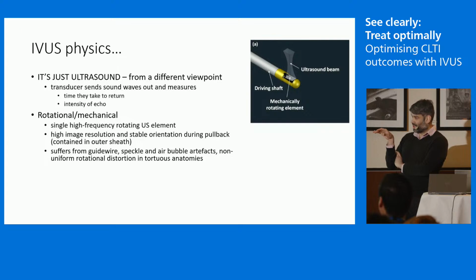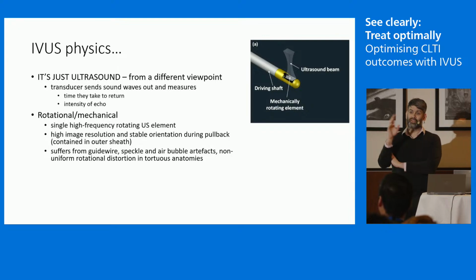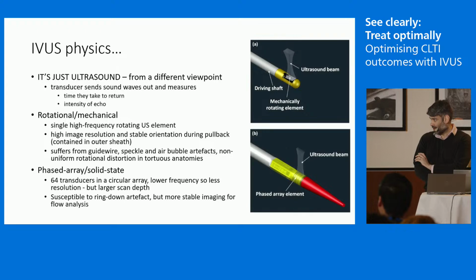I think the Boston IVUS uses this technology. I haven't used the Terumo one myself, but I think it also uses this, just looking at the quality of the image that it gets, and I'll show you an example again in a second.